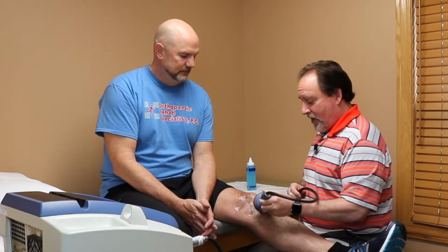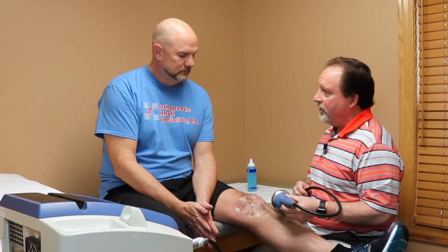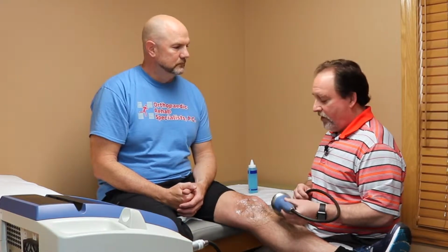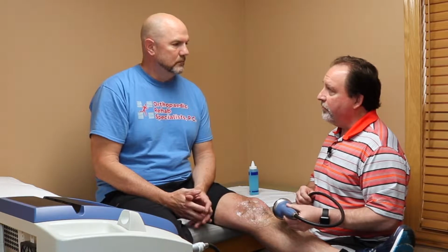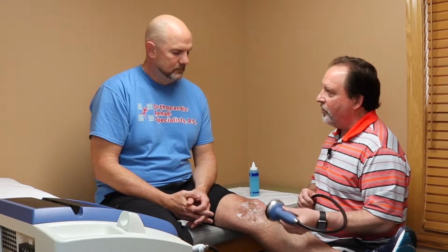The PiezoWave, or what we used to call Wellwave, is sound waves that generate a shock wave into the tissues. So we introduce shock waves into the tissues of various intensities. If there's normal tissue, you feel nothing. If there's abnormal tissue, inflamed tissue, scar tissue, trigger points, you're going to feel usually some discomfort, a little ache, a little pain.